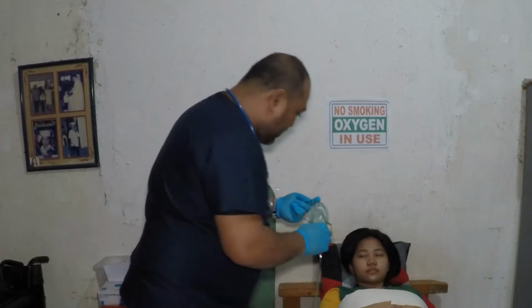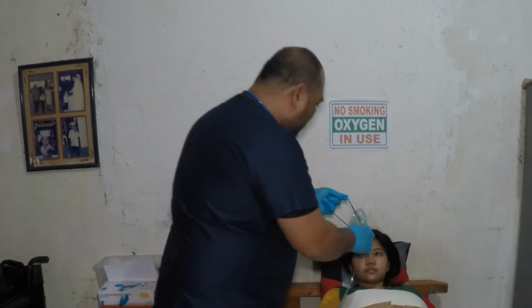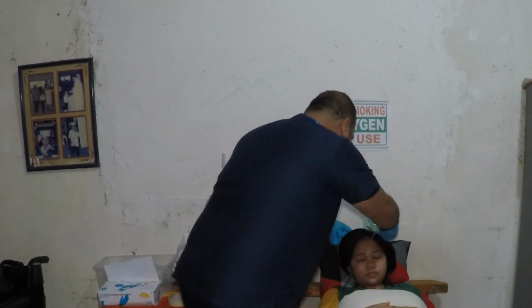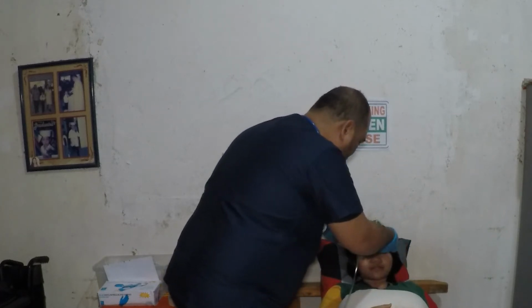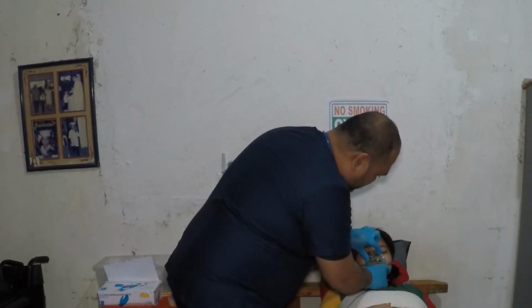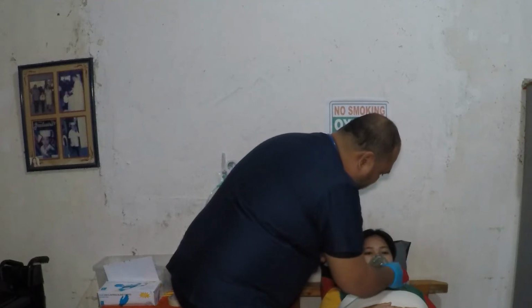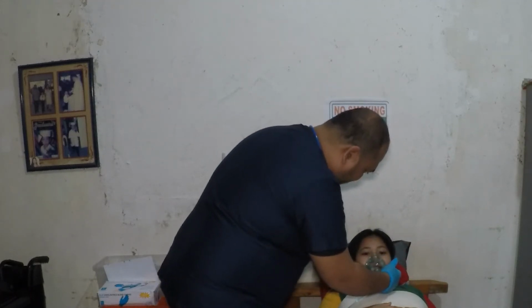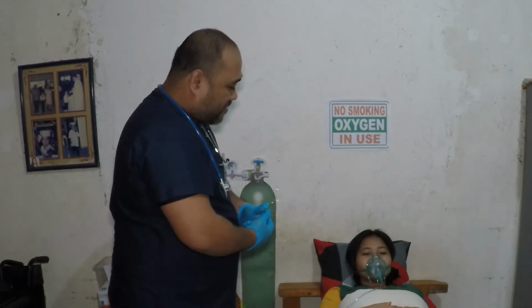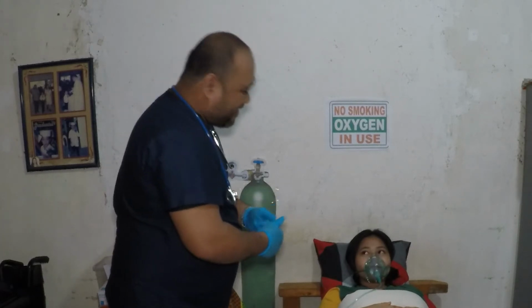Ma'am, we will be using the face mask for your breathing administration. Okay? So can you lift your head, ma'am? Adjust now. Tell me if it is okay or not. Is it okay? You feel relaxed? Okay, so inhale, exhale, ma'am, as normal. Breathe normally. Okay, are you good? Alright.